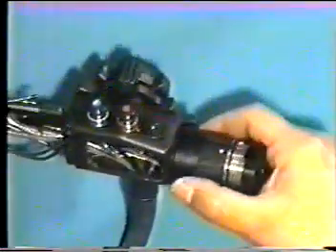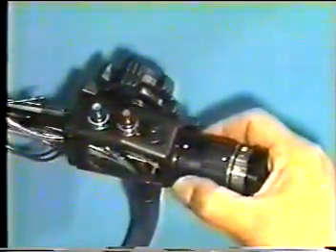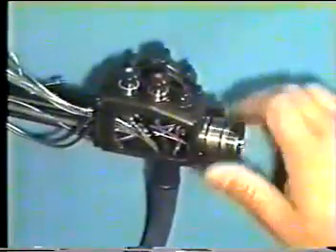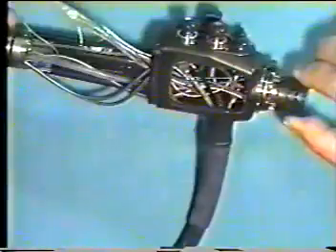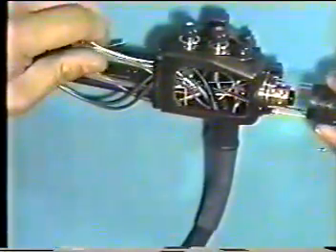How to disassemble eyepiece section. Detach the eyepiece assembly, rotating counterclockwise by some 70 degrees. Remove the ring used for sealing. Remove 2 screws. Extract CGA, that is a cover glass assembly, deliberately by feeding wired solder to CGA.